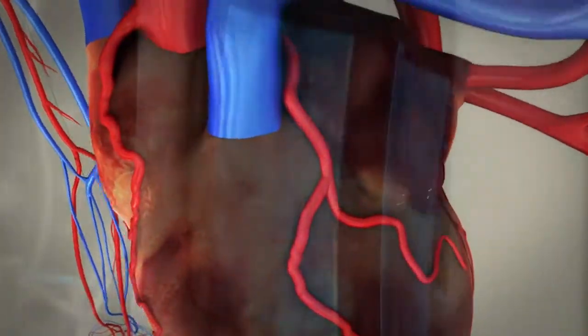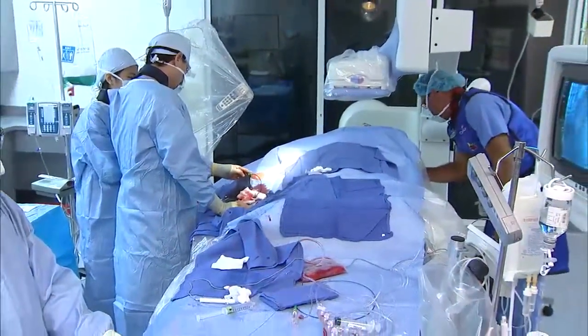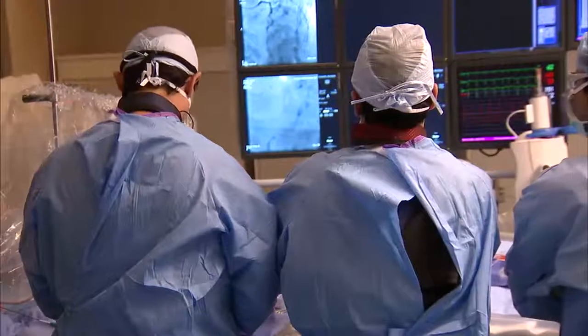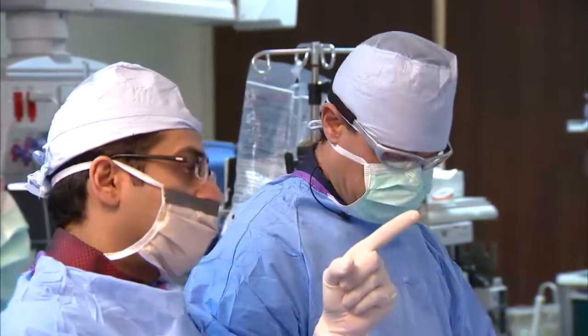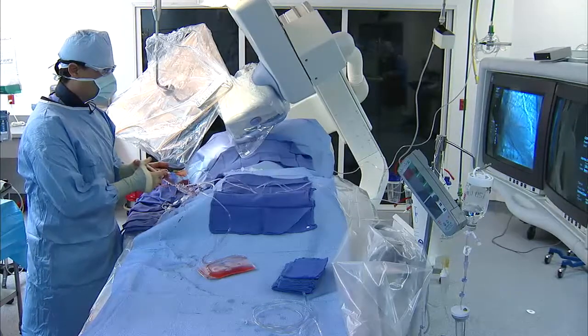Your doctor can determine the extent of the plaque inside your arteries by performing a procedure called an angiogram or cardiac catheterization. An angiogram is an imaging technique that uses X-ray technology together with a special fluid called contrast dye to obtain real-time moving pictures of the blood flow in your arteries. These images can help your doctor identify the exact location of any narrowing or blocked arteries and can also show the degree of plaque buildup. Angiograms take place in a cardiac catheterization lab.